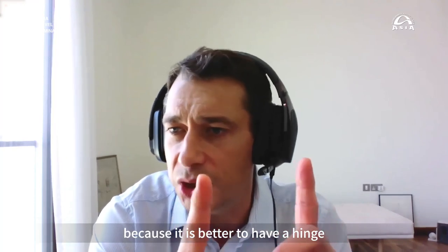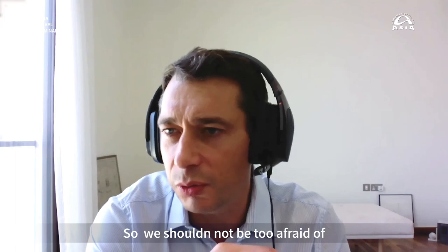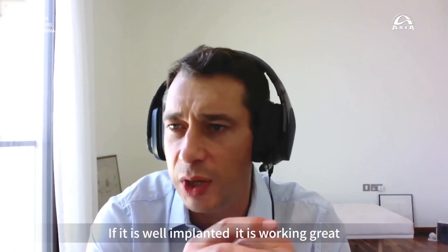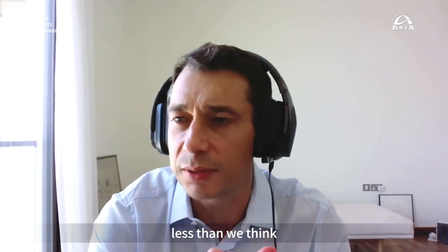Because it's better to have a hinge lasting 15 years than a CCK unstable that you have to revise after 1 year. So we shouldn't be too afraid of a rotating hinge arthroplasty. If it's well implanted, it's working great, and there's not much wear, there's not much loosening, less than we think.